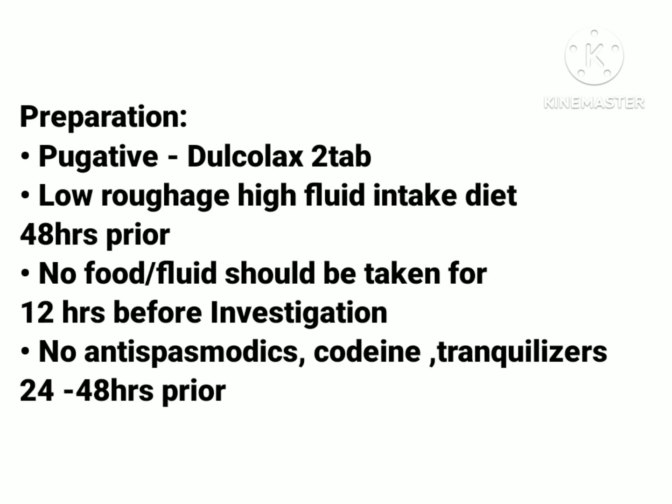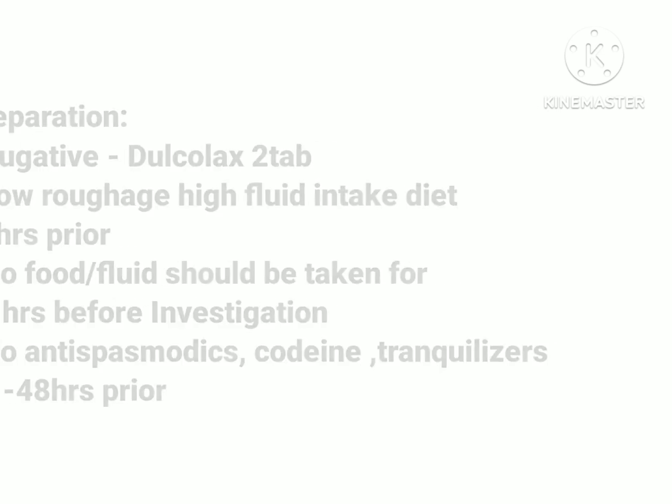Next preparation is a low roughage, high fluid intake diet taken by the patient 48 hours prior to the examination. Next preparation is no food or fluid should be taken for 12 hours before the investigation. It means the patient should be fasting 12 hours before the investigation. Last one is antispasmodics or any tranquilizer medicines are stopped 24 to 48 hours prior to the examination.